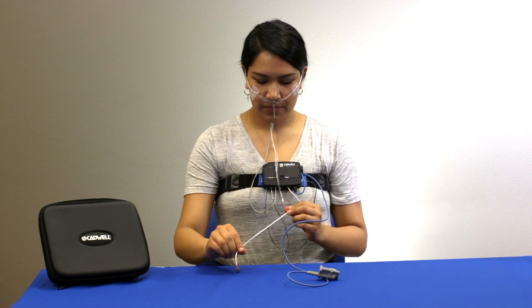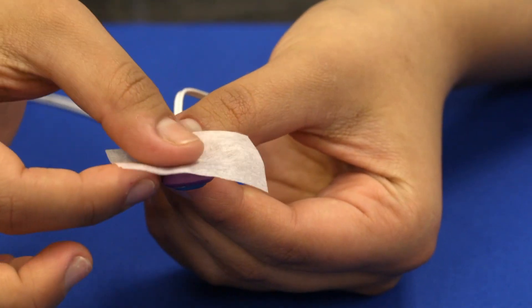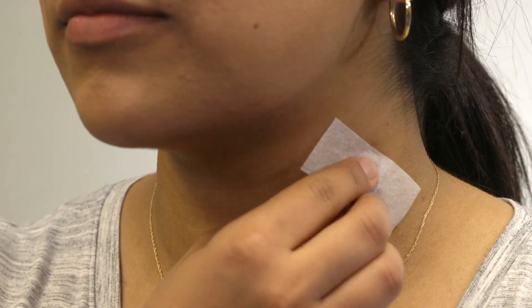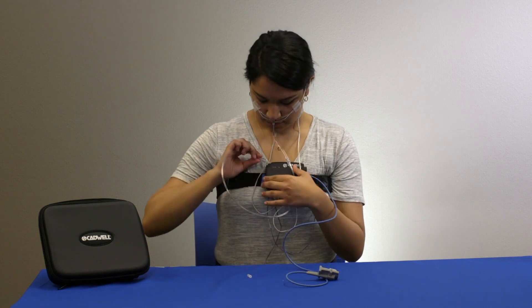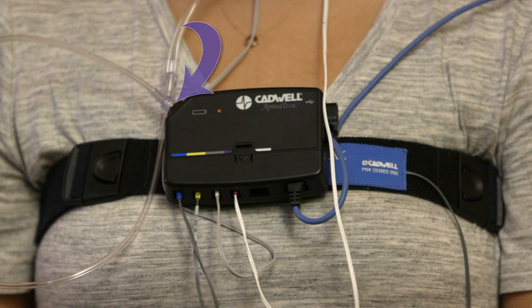Tear off a strip of tape and stick it to the purple side of the snore sensor. Place the blue pad of the snore sensor against the skin on your neck and push the tape down to ensure the sensor is secure. Use extra tape if needed. Twist off the cap on the end of the cannula tubing and attach the cannula by gently twisting the tube onto the metal connector on the top of the apnea track.